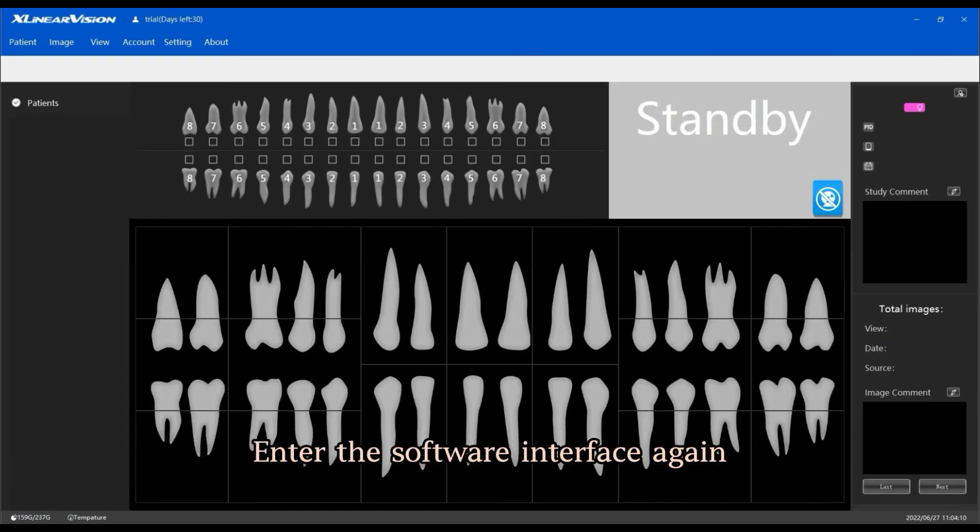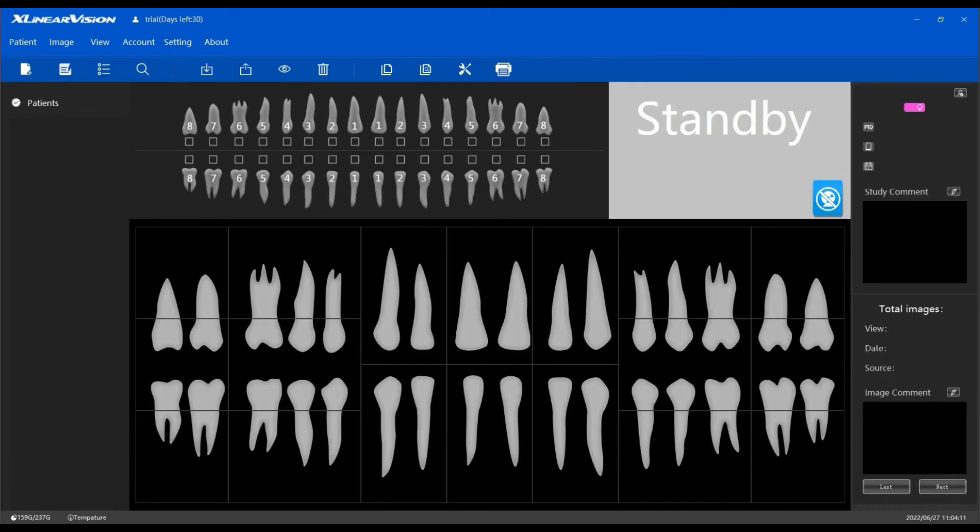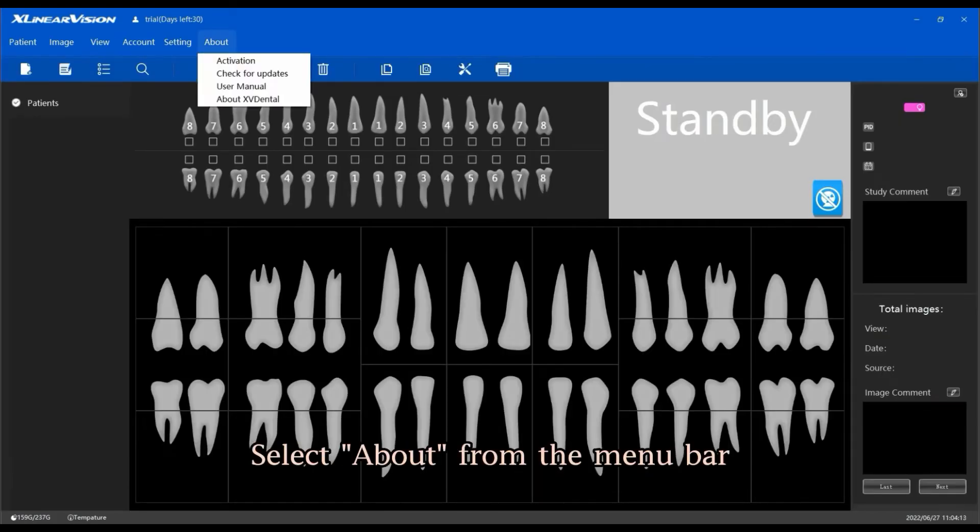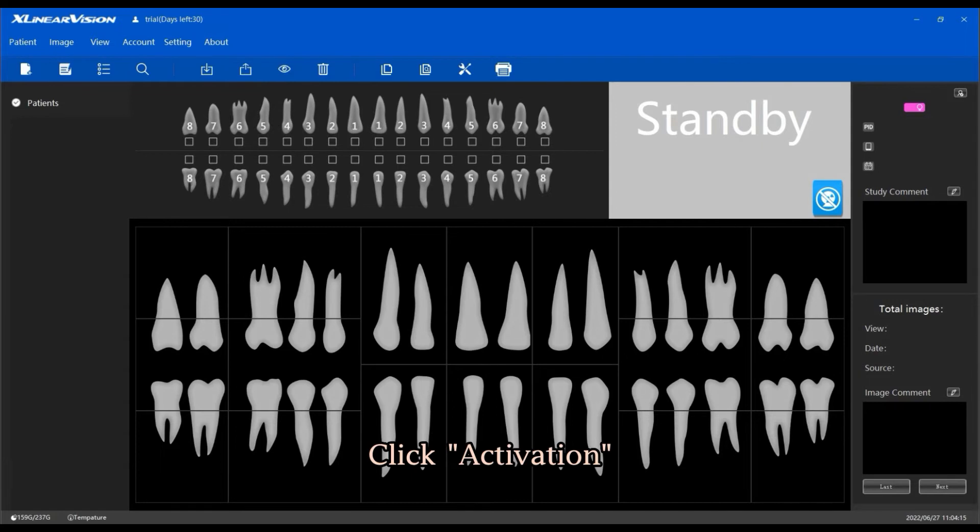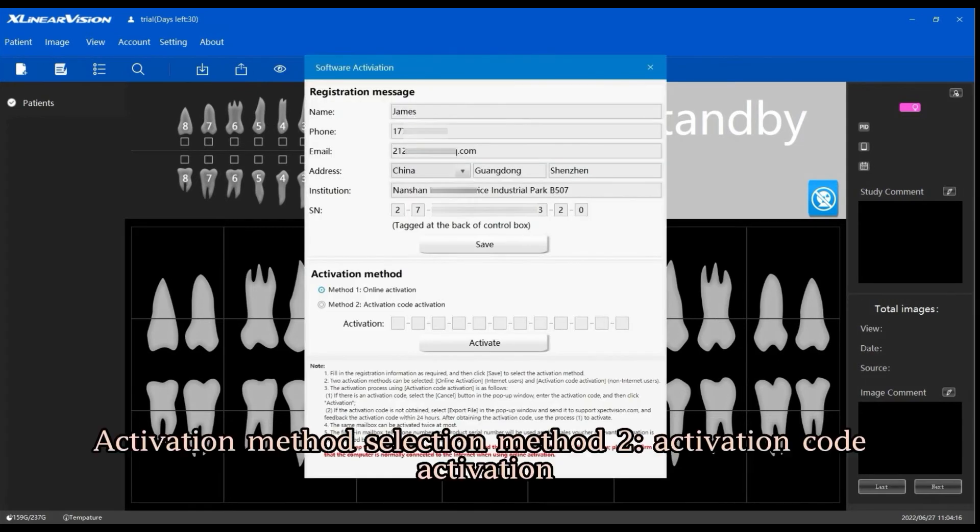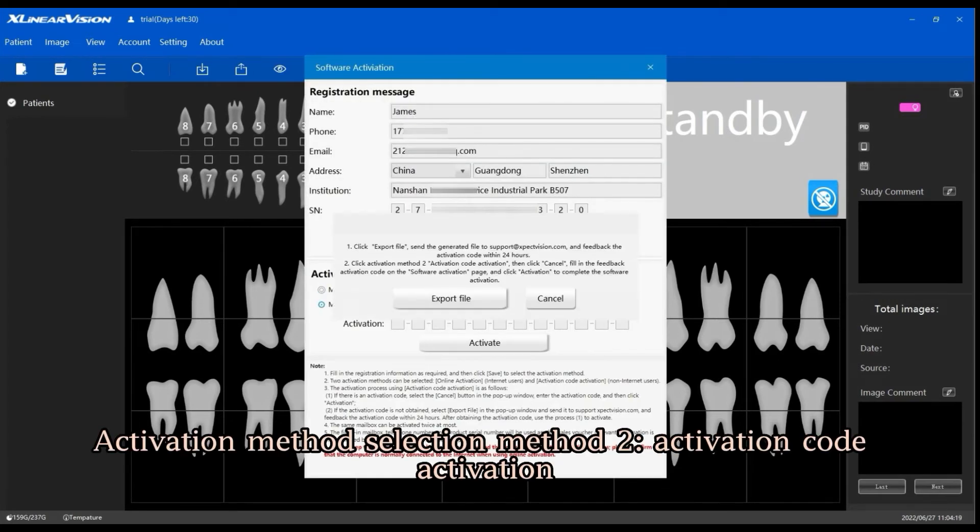Enter the software interface again. Select About from the menu bar and click Activation. For activation method, select Method 2: Activation Code Activation.